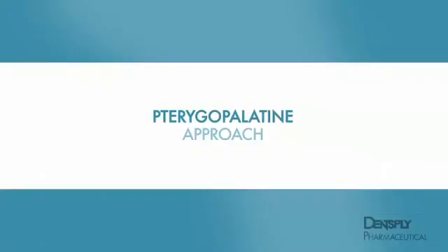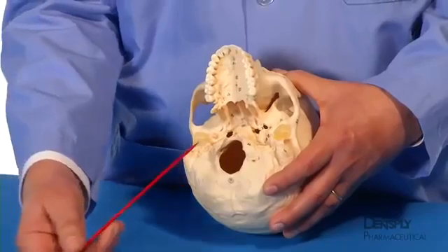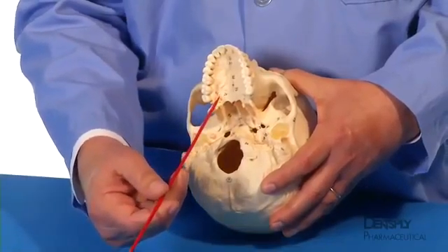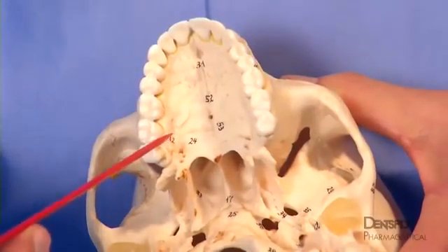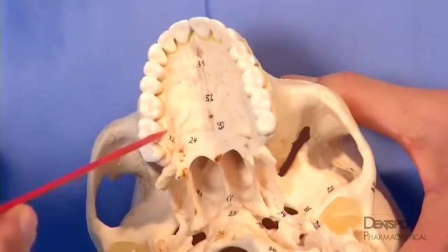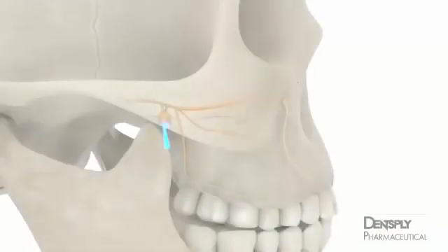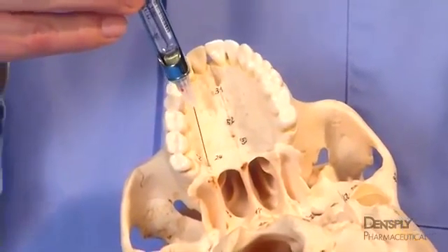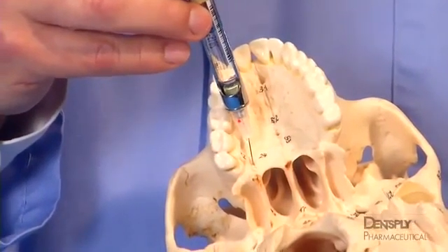Pterygopalatine approach. The pterygopalatine approach to the maxillary nerve block uses the greater palatine foramen as the insertion point and the pterygopalatine canal to guide the needle to its target. The foramen is usually located adjacent to the alveolar bone between the distal half of the second molar and the mesial half of the third molar. The pterygopalatine canal travels upward and backward to reach the pterygopalatine fossa. When the needle is inserted to a depth of 30 millimeters for the average adult, the tip will lie 1 centimeter beneath the maxillary nerve.